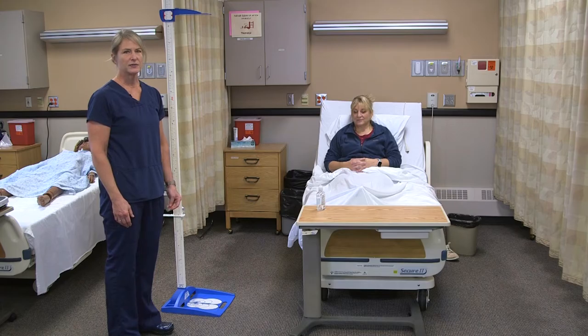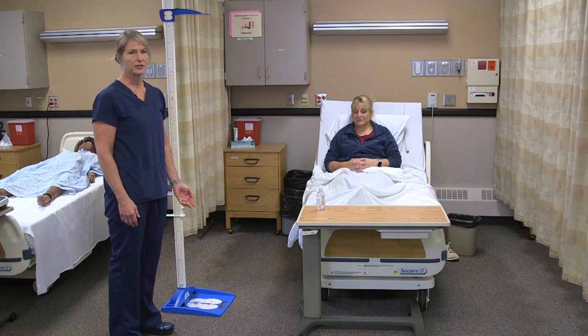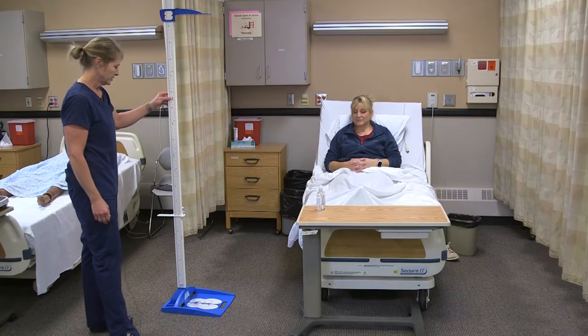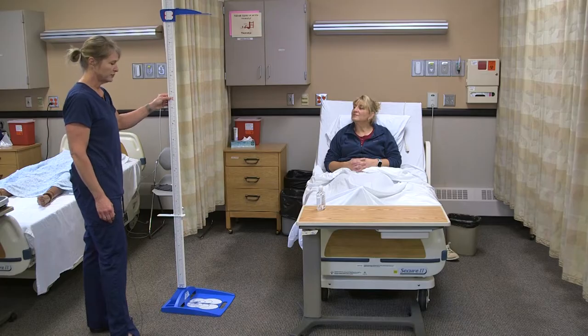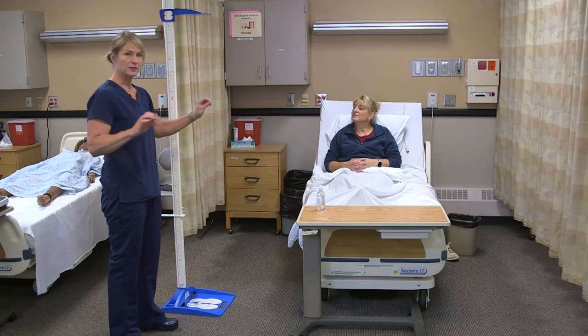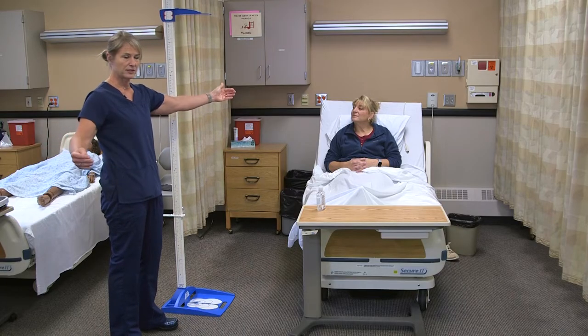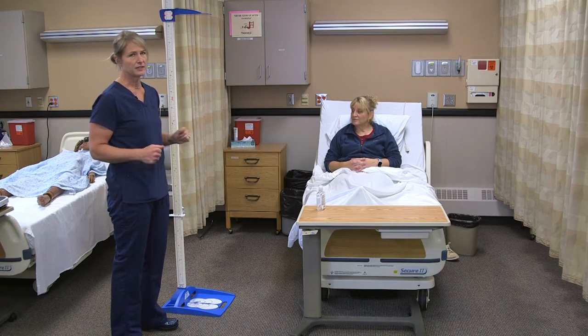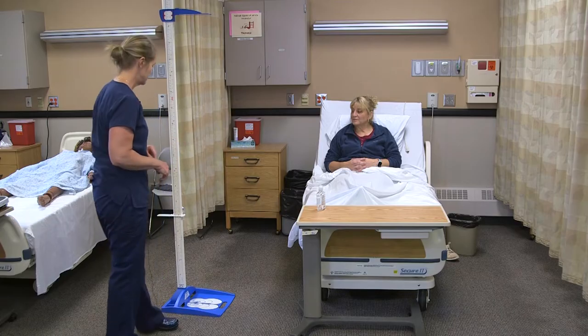To get the height of a resident, it will depend on what equipment is available in your facility. In this scenario, we're going to use a tool that can be brought to a resident's room. You could also have the resident lie flat in bed and use a measuring tape from their head to their toe. Typically it's in the medical record, so it doesn't have to be done very often as it doesn't fluctuate like the other vital signs we need to collect.